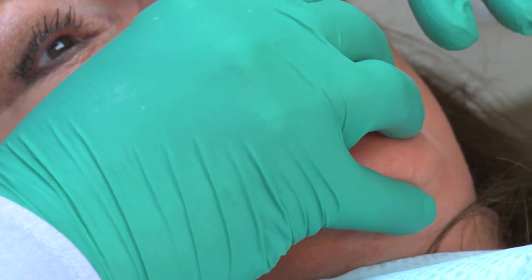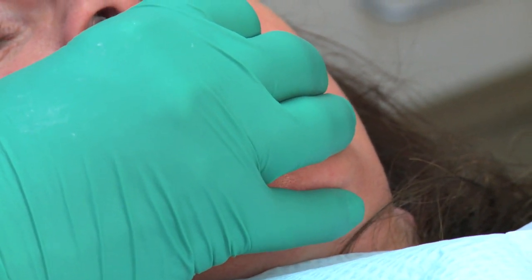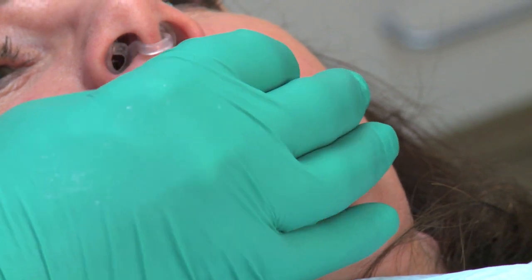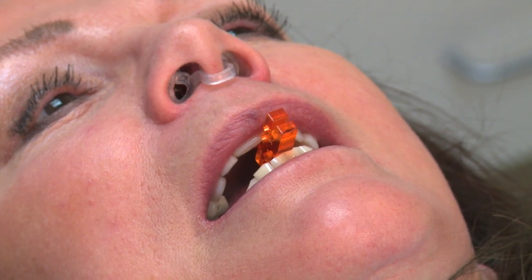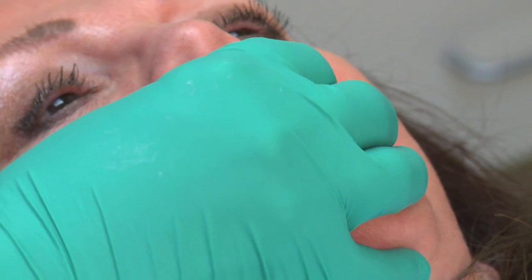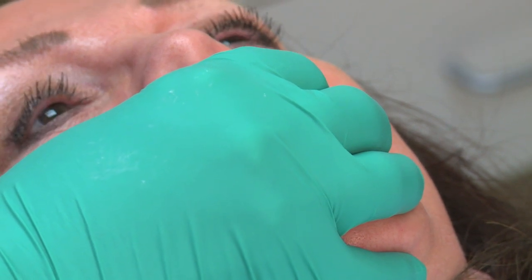Go ahead, Kim. Now once again, I'm going to take my fingers off the key for video purposes only so that you can see it more clearly. Don't have the patient inspire without holding the key due to aspiration. Seal your lips, Kim. Give us your best snore. I'm not hearing anything. Try again.